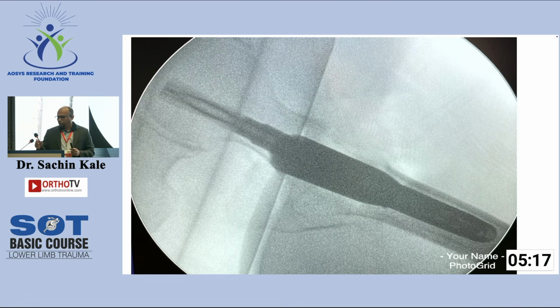Okay, I'll go to one more topic, which is he has a question. Yeah, go ahead. What is your implant? It depends. The first concept should be clear: the implants are not going to achieve reduction. The reduction has to be done by the surgeon. If it is not coming close, do open reduction. His question is, when do you use a helical blade versus a screw? Very important question here.